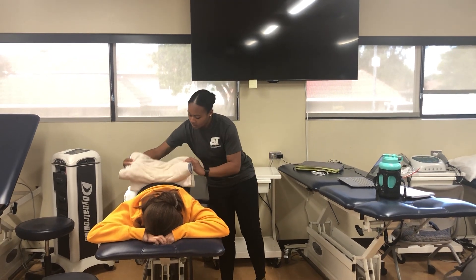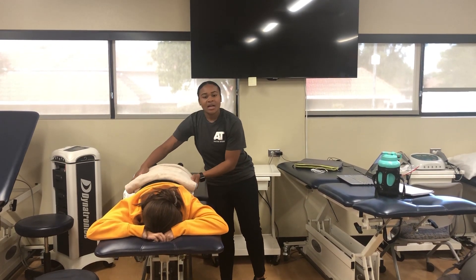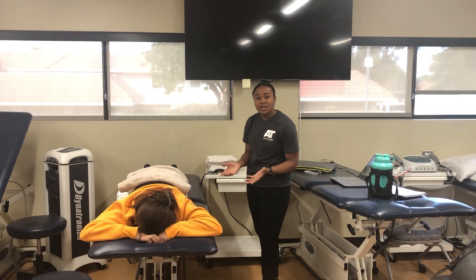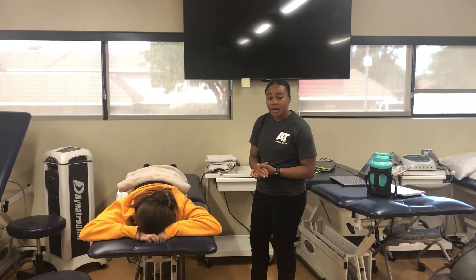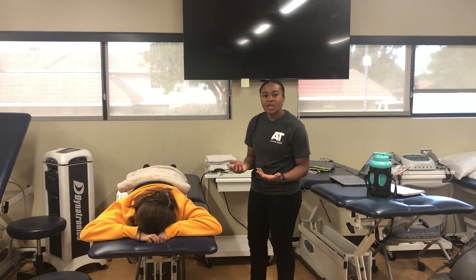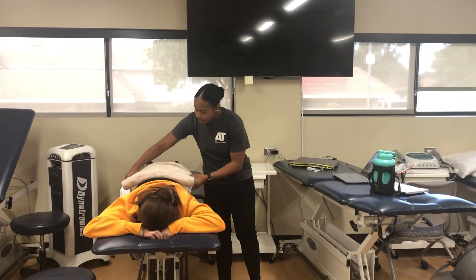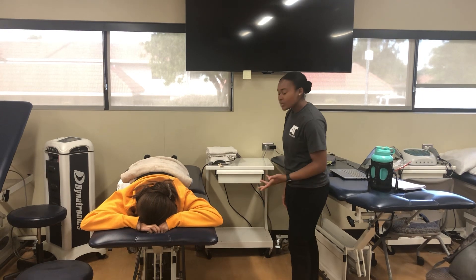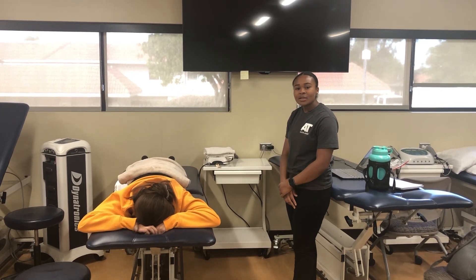Apply the hot pack, making sure it is appropriately layered. Treatment time usually goes between 20 and 30 minutes. Check in with your patient every five minutes to see how effective the hot pack is. Also, don't forget to ask your patient if they have used a hot pack before, and educate them on it. Once it's nicely in place, allow the patient to receive the treatment, and that concludes the process.